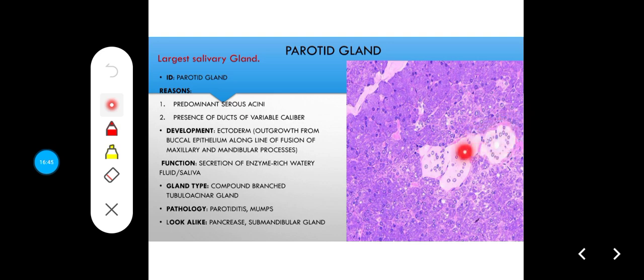Mucous acini don't take up the hematoxylin and eosin stain, so they appear pale. They are not like the irregular discolored patch on the pancreas. Look at this. You can also appreciate the orderly arrangement of the cells into acini, surrounding a central space. They don't take up the stain due to the kind of secretion. The mucin contains complex carbohydrates that don't stain well.